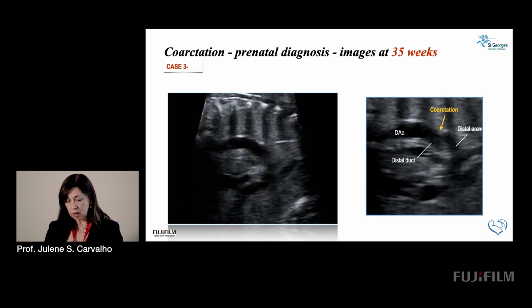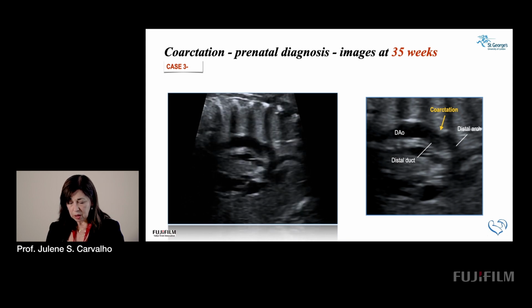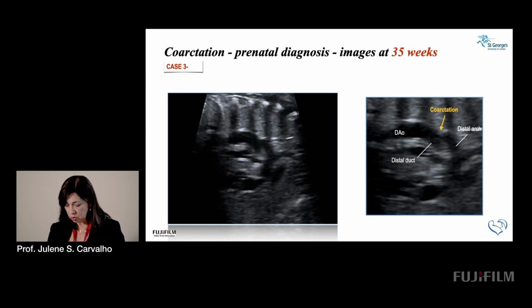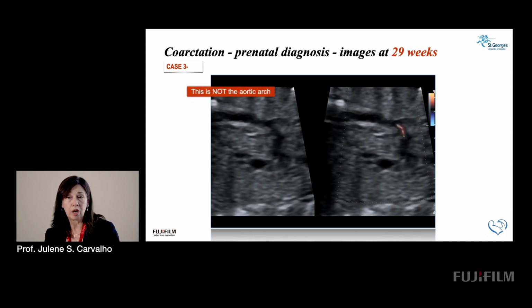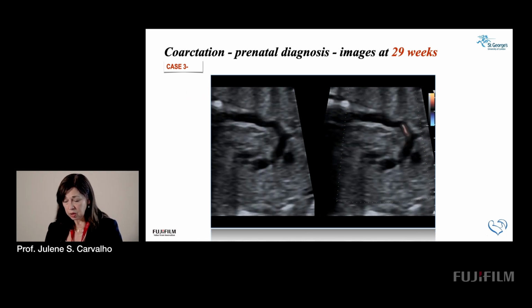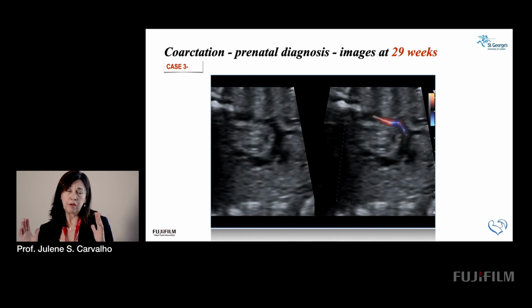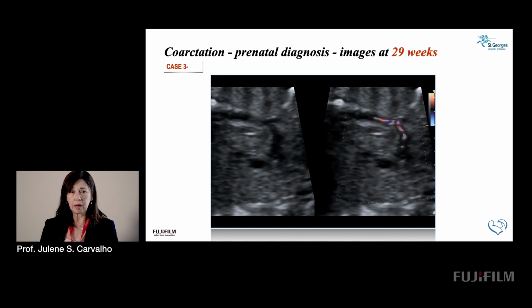And you can see here the two vessels are very close together. So the aorta is smaller, and when you see a big one, that is not the aorta, which is the message on the next scan. So it can be misleading if you look at these and you think that this is the aorta. This is not the aortic arch. The aortic arch is separate, and you can see how the color helps separating that. But you have to have everything optimized, a narrow sector. You put a color box on the area that you want to see.